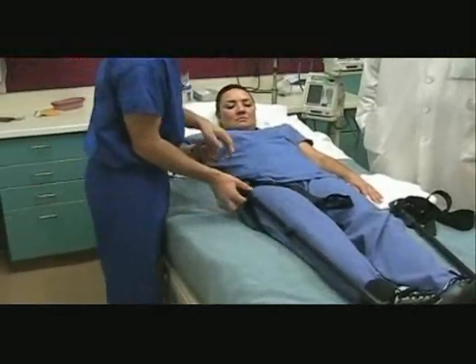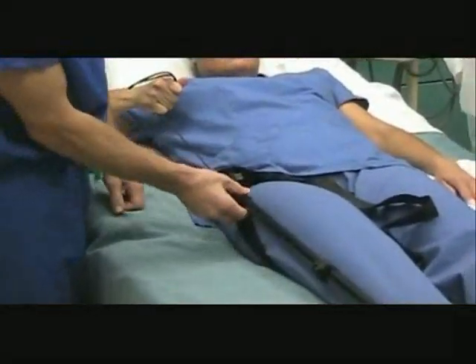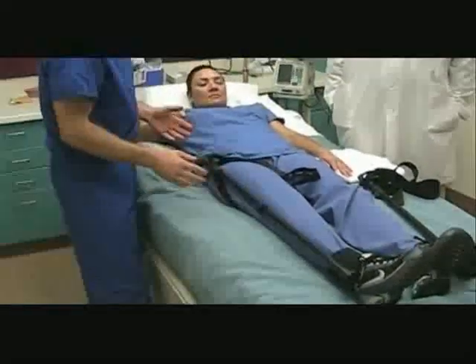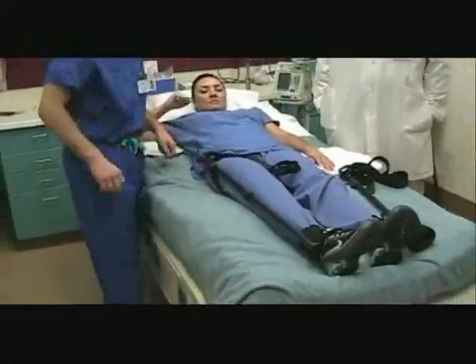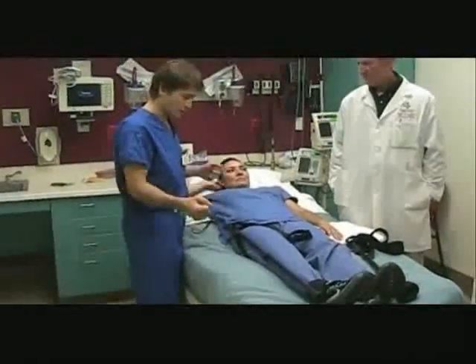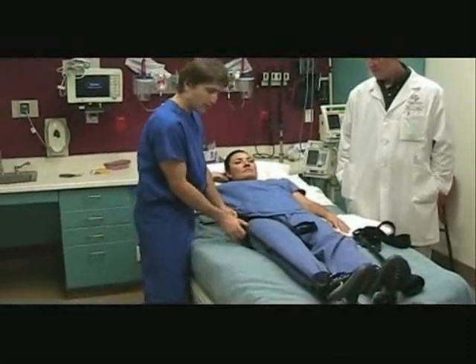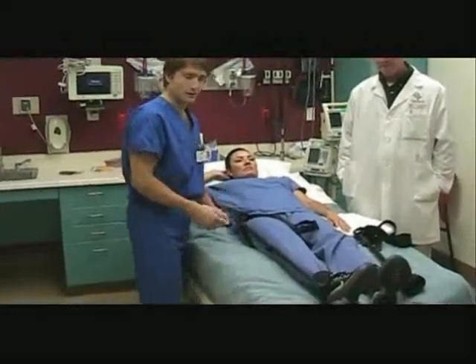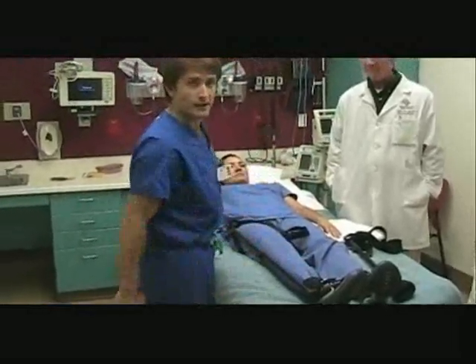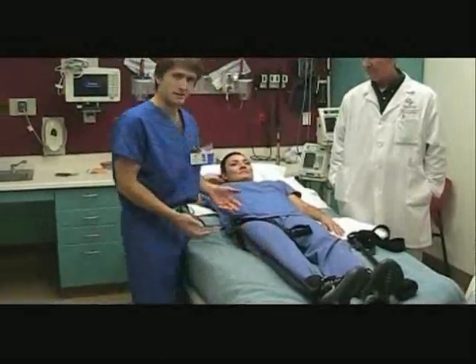Pull in this direction here. Basically the leg is being stretched and then locked in place — so now there's traction applied to the leg. If needed, you can let go of the cord. If there's too much traction, it can be easily adjusted. You may also do that if there's lack of pulses in the foot or tingling in the toes. The point is, it's just easily adjusted.